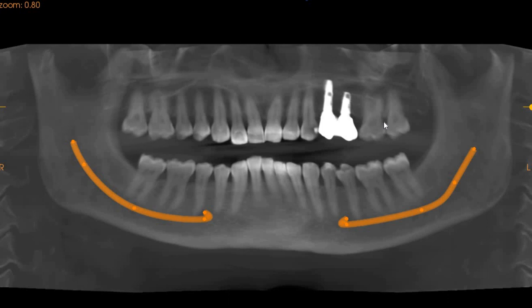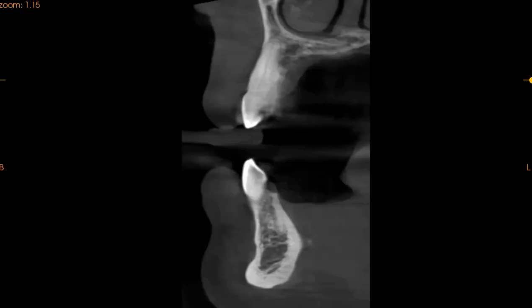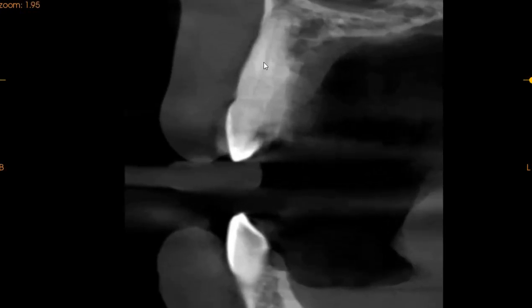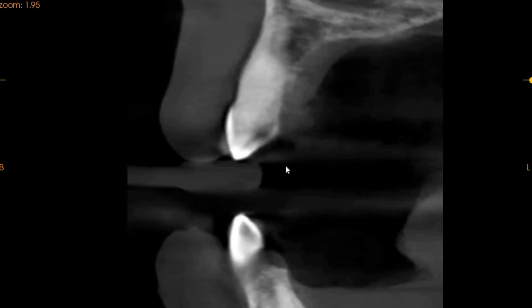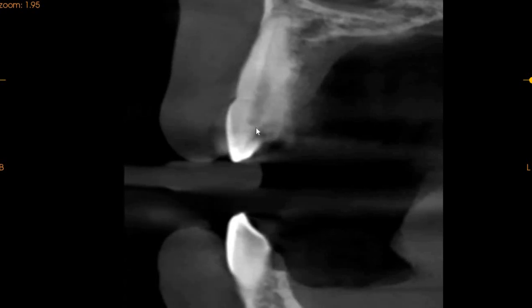We've got 2 implants placed, and then we've got the 6 which seems to have no restoration. Now on the trans-axial view, here we can very clearly see that the lesion in tooth 3 is just extending into the pulpal region.